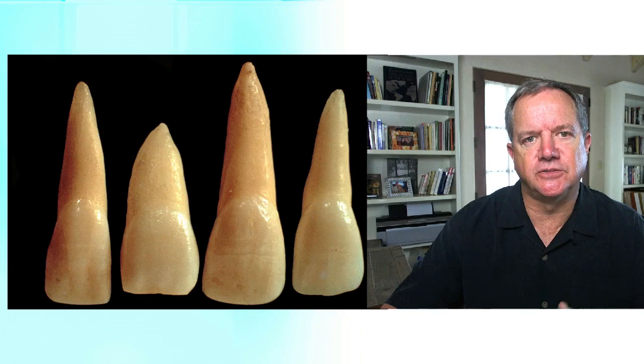What I'd like to talk to you about in this segment is the refinement of tooth form. We've gone through the embrasure form to a large extent, but I just want to review some things about natural tooth form and then also talk about facial surface morphology. I find it very helpful to look at extracted teeth when I'm trying to remember how to carve temporaries.